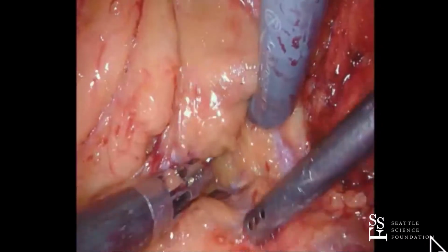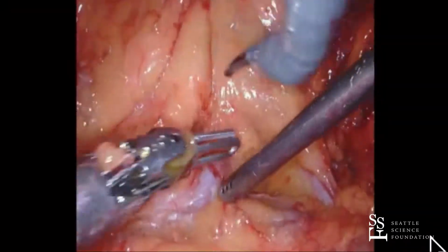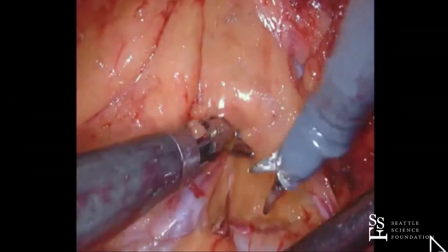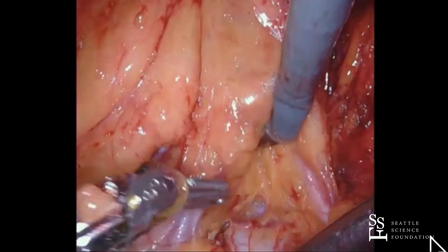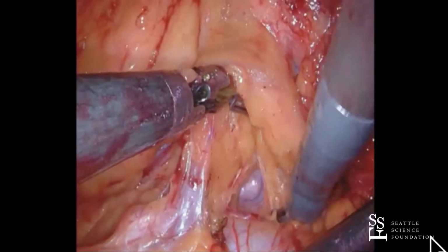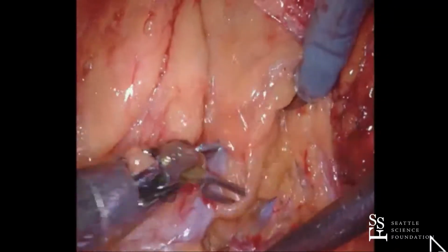So, Ronnie, I'm very fascinated with retro, but I don't do my pyeloplasties retro for that very reason, in that suturing on the other side of the crossing vessel I found to be very difficult. So I did a few, and then I just went back to trans because it just was better for the anastomosis. Yeah, I agree with you. I've only done it a couple times, again, just to avoid a hostile abdomen. But usually you know from your scans pre-op whether or not you have a crossing vessel. You can usually see it on your CT.